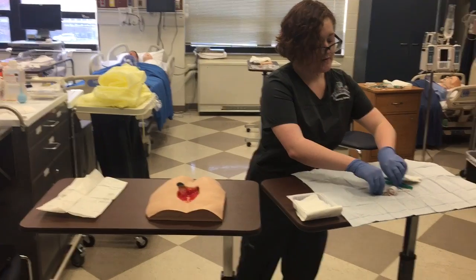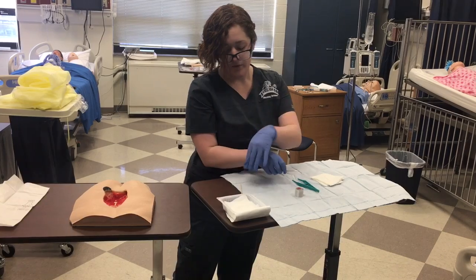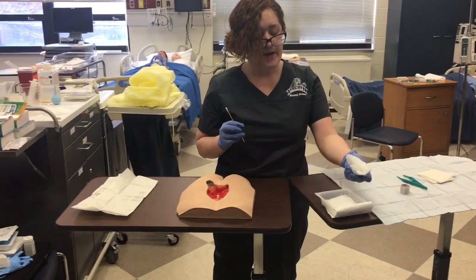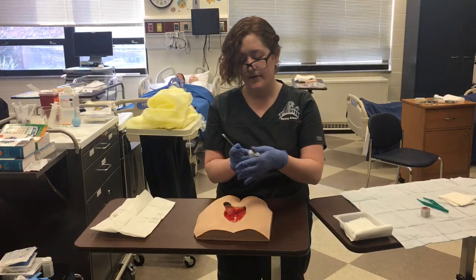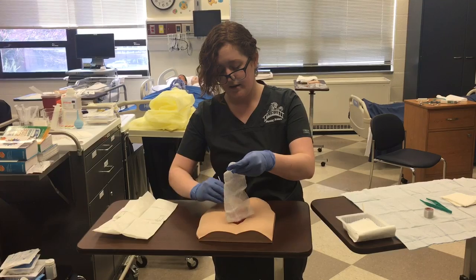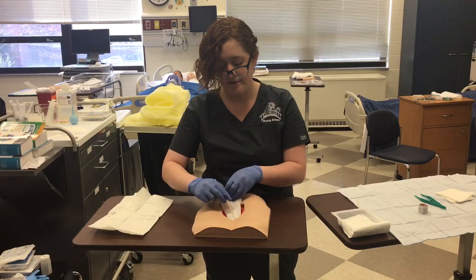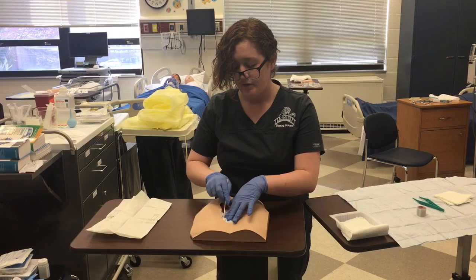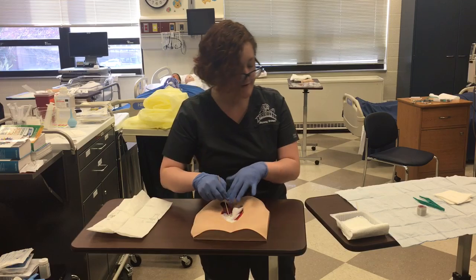I'm going to be using a cotton-tipped applicator. That one rolled off the sterile field, so it is no longer usable, so I'll use this one instead. I'm going to take the gauze, wring out any excess, unfold it, and then ensuring that I'm not touching the outside skin and compromising the sterility, I'm going to pack the wound. I'm going to make sure that I am not overpacking it. Be very conscious of that.